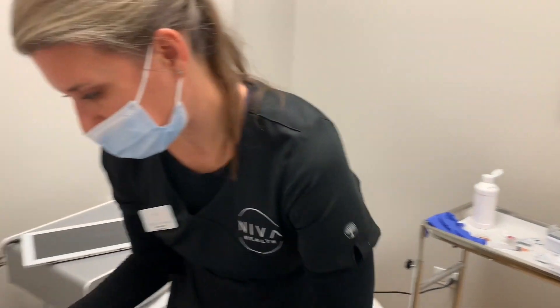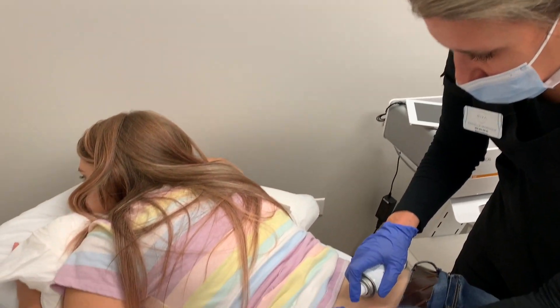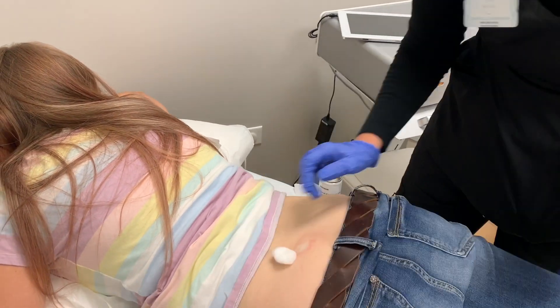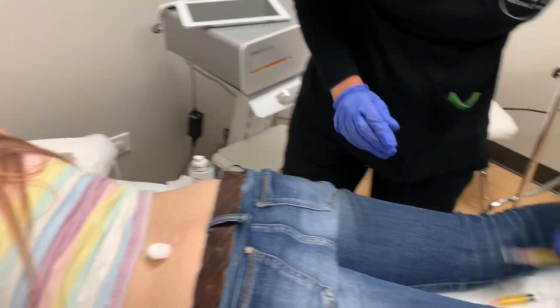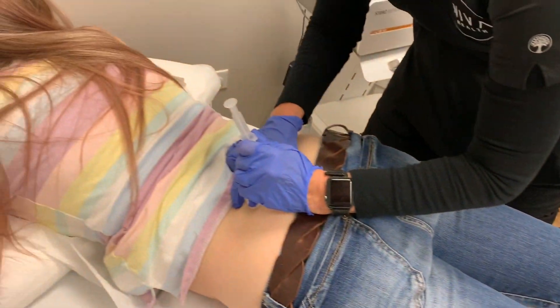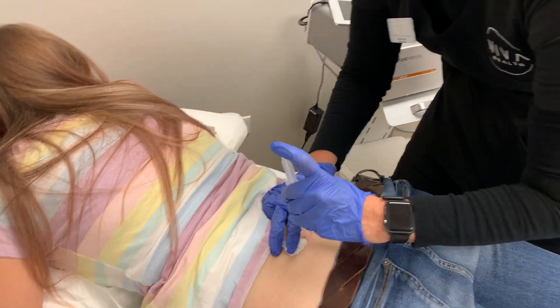It wasn't bad — it's just pressure. You might actually feel lumps there. We got four of them — we're doing four syringes.